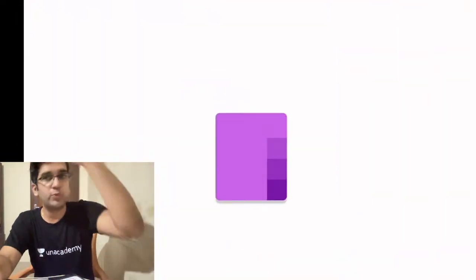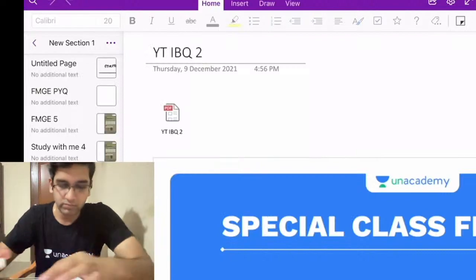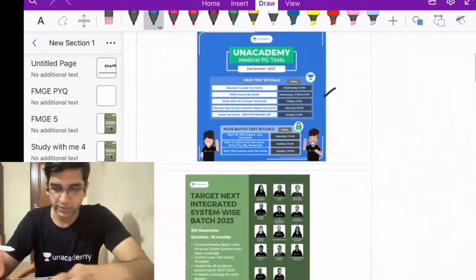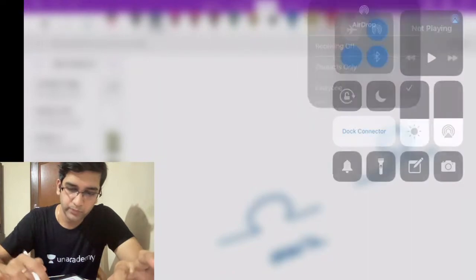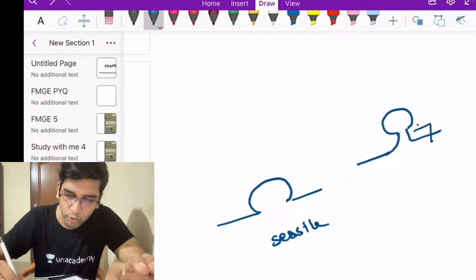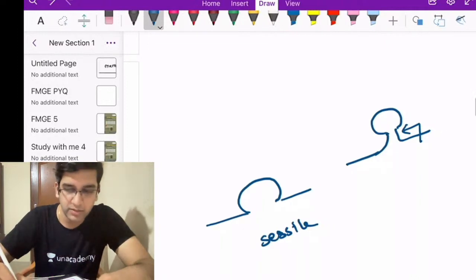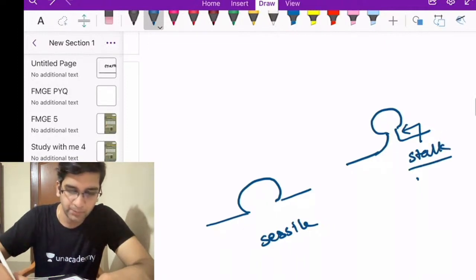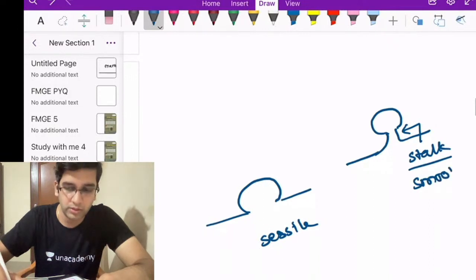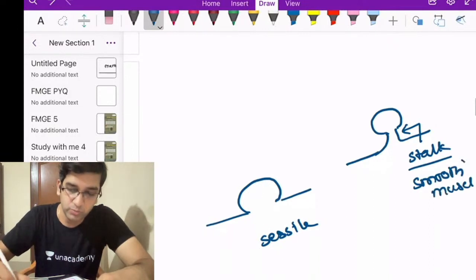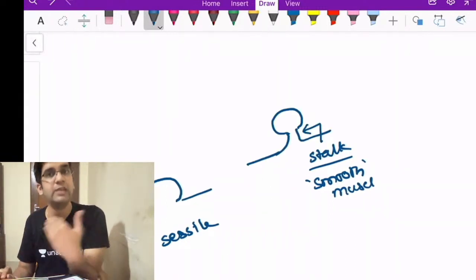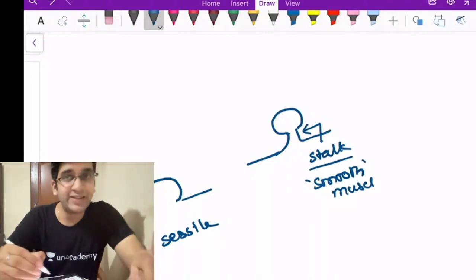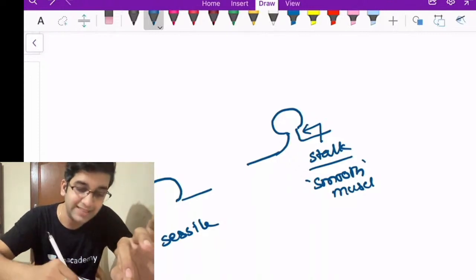The appearance looks like a Christmas tree — that's what prompted the Peutz-Jeghers answer. But looking at this pedunculated polyp, this stalk part will also have smooth muscle. Don't consider that smooth muscle as part of the Peutz-Jeghers polyp — smooth muscle is normally seen in any pedunculated polyp. I'll call it Peutz-Jeghers only when I have smooth muscle in the glandular surface.